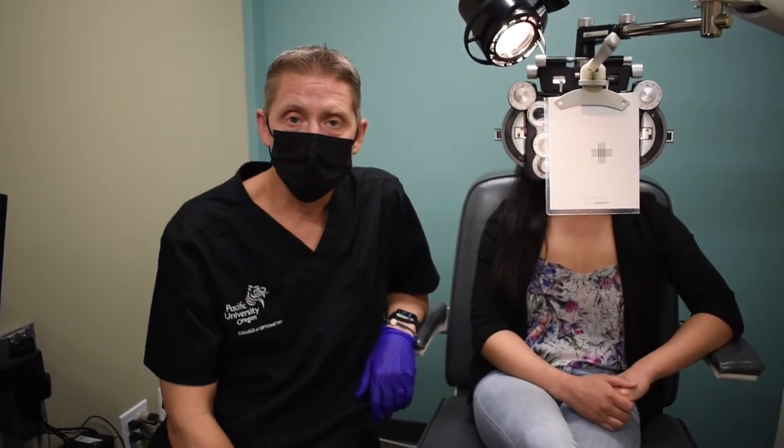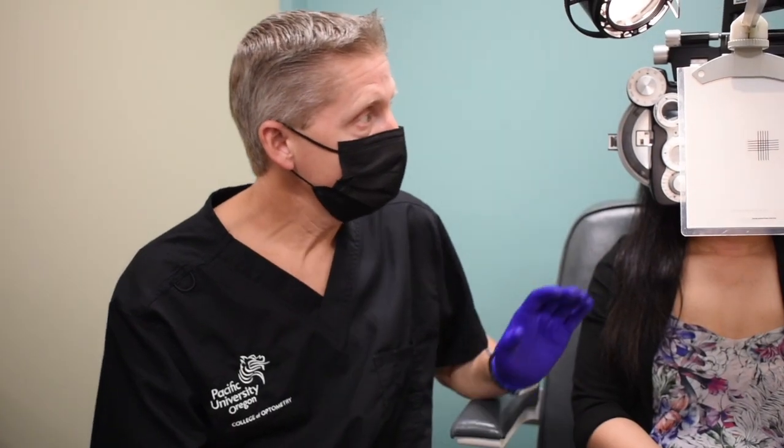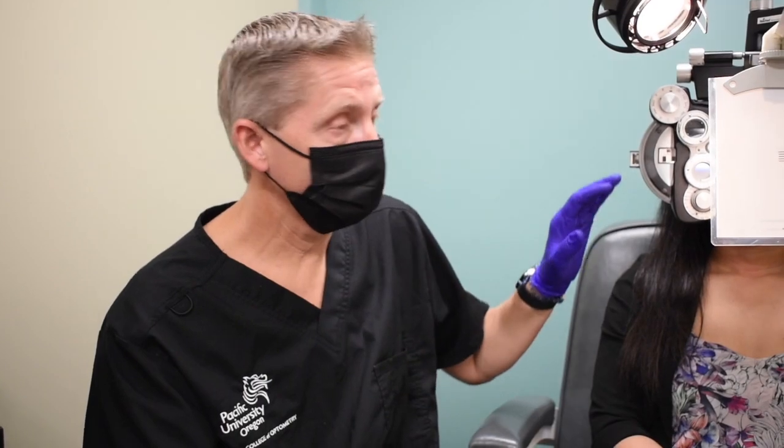Both eyes are open when we're doing our negative relative accommodation and positive relative accommodation. There are variances where you'll do a monocular PRA and a binocular PRA, which allows you to assess the individual accommodative skill of an eye relative to the vergence system. But for this example, I'm only going to show you the binocular NRA PRA tests.